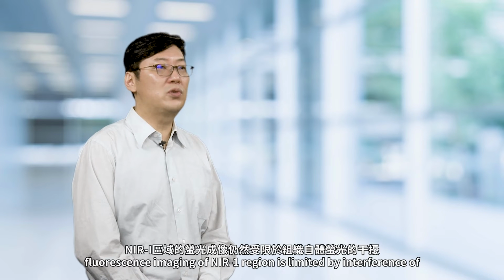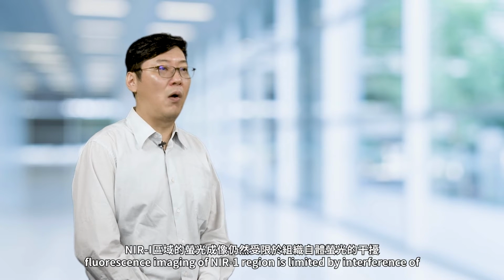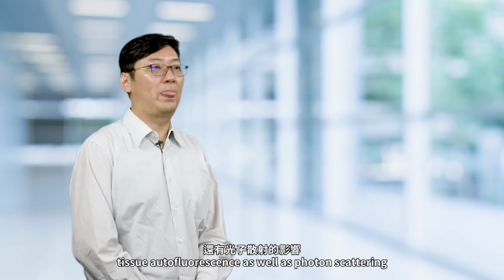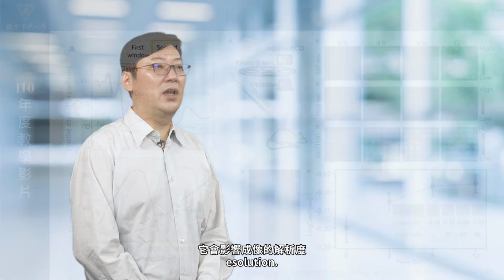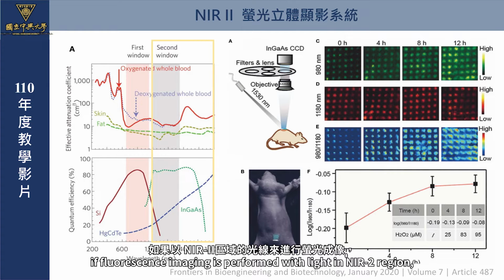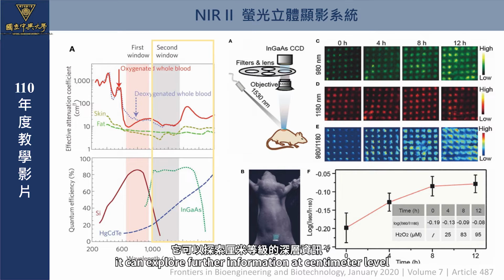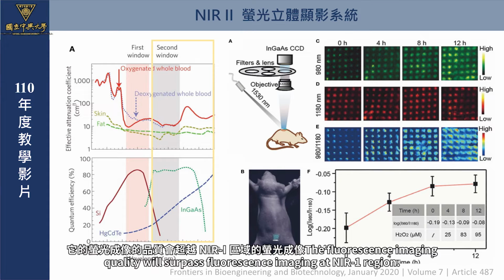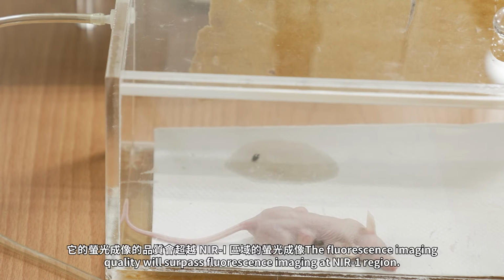In fact, fluorescence imaging of the near-1 region is limited by interference of tissue autofluorescence as well as photon scattering that affect the image resolution. The results of recent in vivo and mimic experiments show that if fluorescence imaging is performed with light in the near-2 region, it can explore further information at centimeter level and obtain depth resolution at millimeter to micrometer level. The fluorescence imaging quality will surpass fluorescence imaging at the near-1 region.